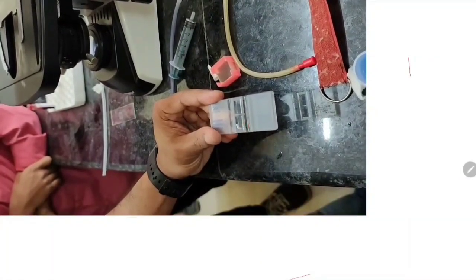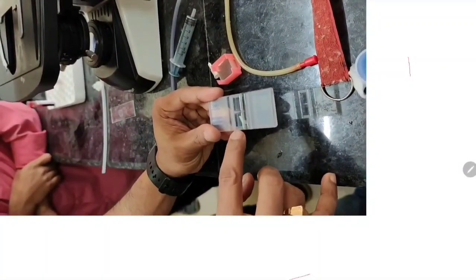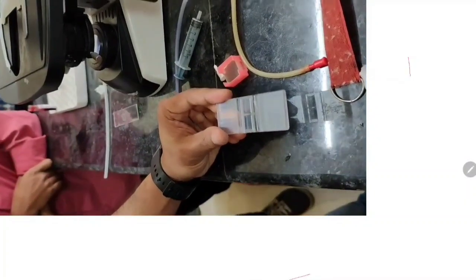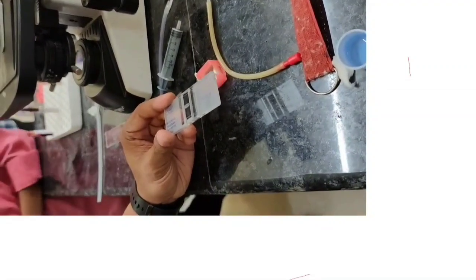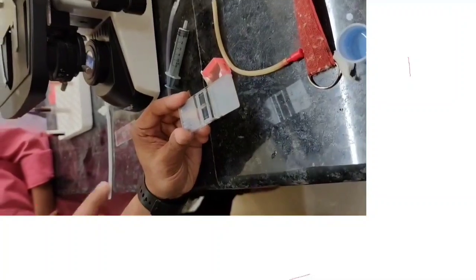We can fill both sides, or any one side, or sometimes we can use one side for RBC and the other side for WBC. But here we are going to fill this gap of 0.1 millimeter with the prepared fluid. And how will we charge it? Let me show you how to charge it.